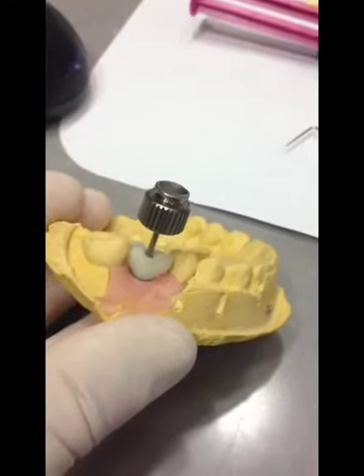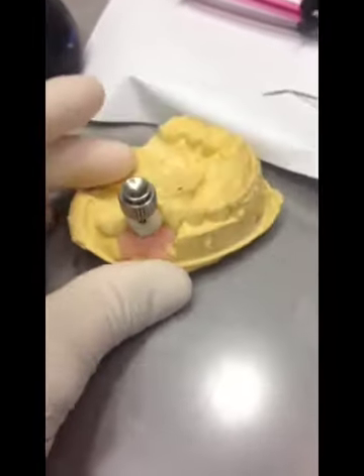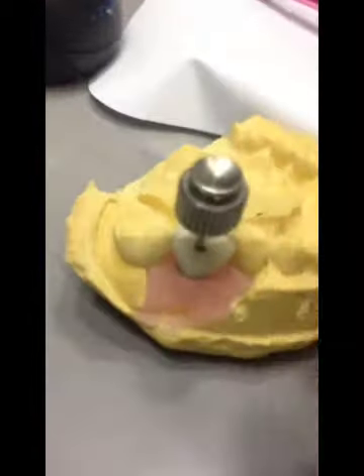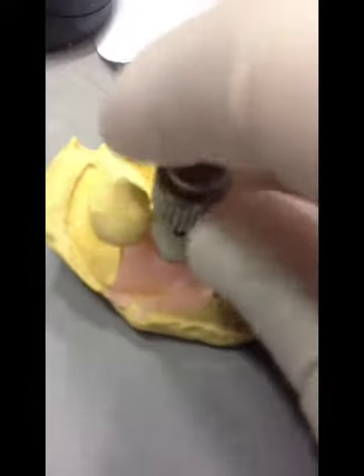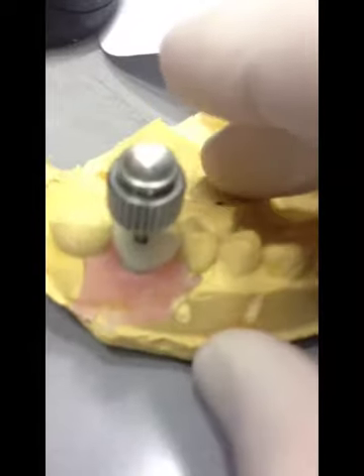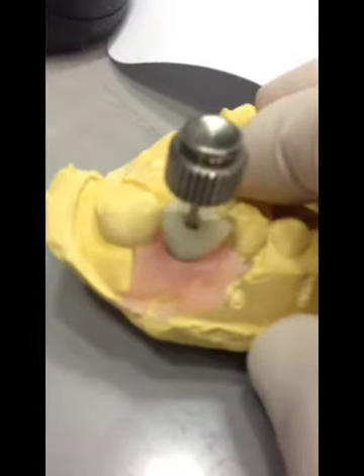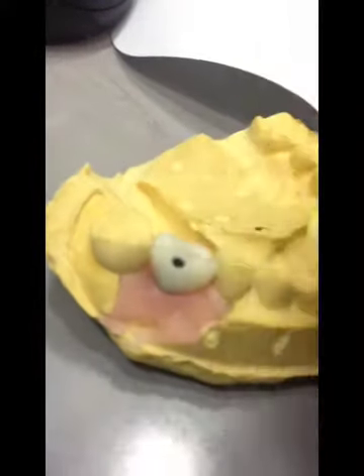And here it is, just the last time being screw retained here. You can see how that fits in there smoothly. And do make sure to put the screw back in to the implant prior to seating it. Sometimes it will take a little bit of additional torque just to get it past that initial opening there. And so you want to make sure that you're not putting that torque on the implant itself, and you can just put all that torque on the analog.